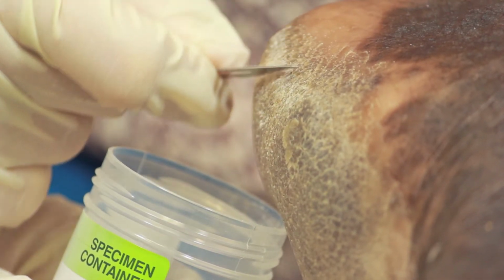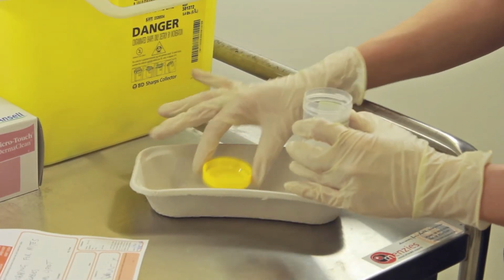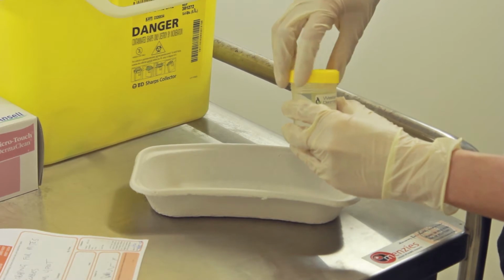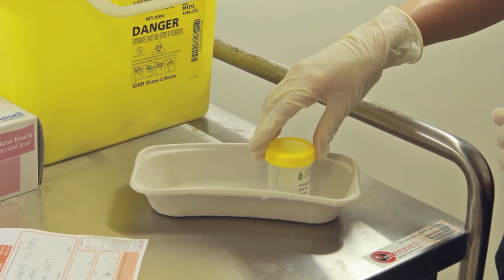Ideally, scraping should be taken from where scaly skin occurs. A few pieces of skin may be sufficient. However, try to collect as much skin as possible. Don't rush the process. The more skin collected, the greater the chance of collecting mites and confirming their diagnosis.